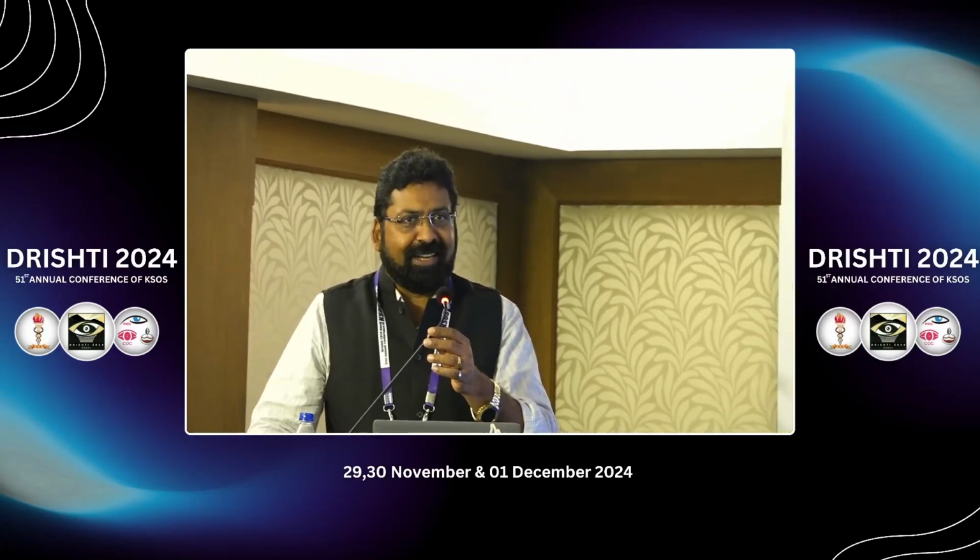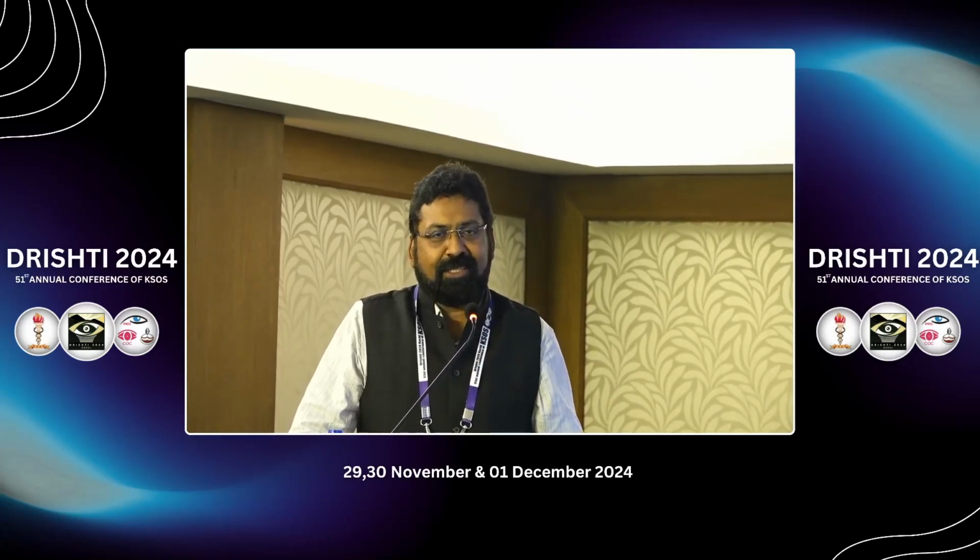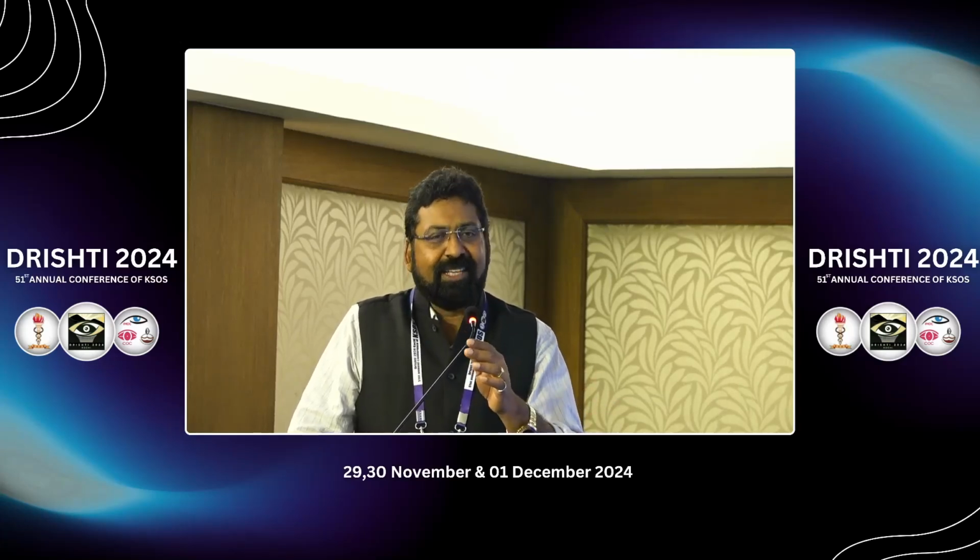Your opinion on Sulcoflex lens? I have used it some time ago, but not recently. Now it is not available, unfortunately. I tried for a patient, but Sulcoflex is now not available. Piggyback definitely works. It is a much more atraumatic procedure. You don't need to cut the lens. You can put it. I've used a couple of lenses to correct the residual myopia, as well as a multifocal. The other eye multifocal and Sulcoflex multifocal, but that's a refractive lens. That's the only problem.